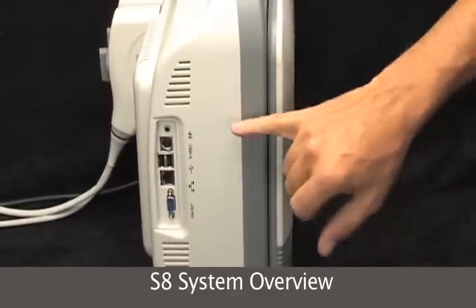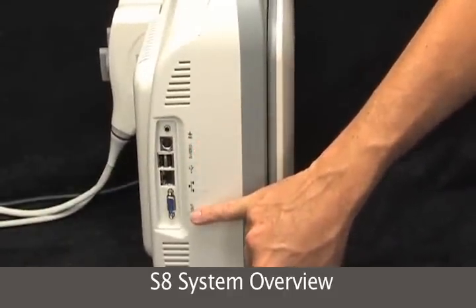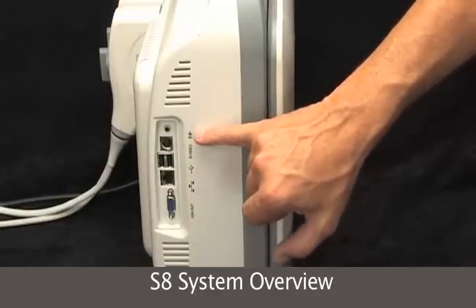On the side we have our S-Video, VGA out, networking and USB ports, and audio out.